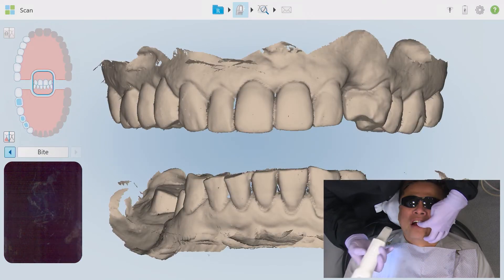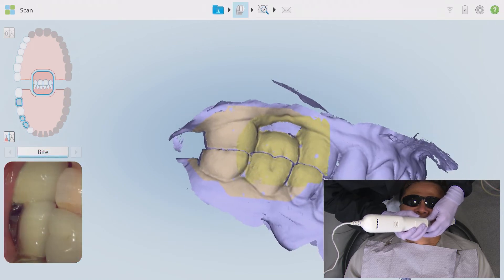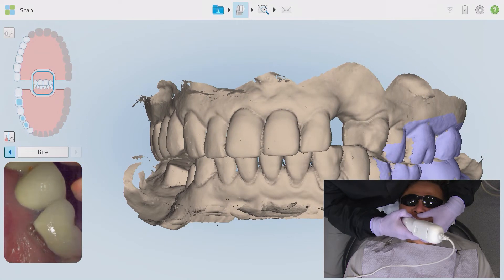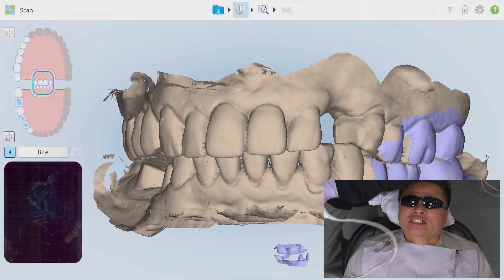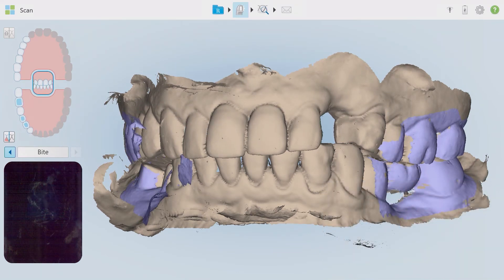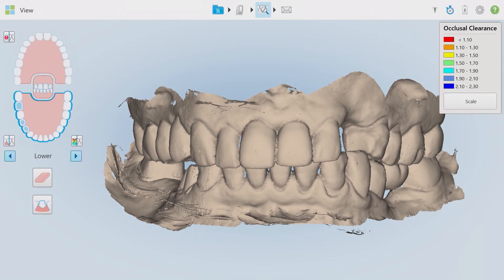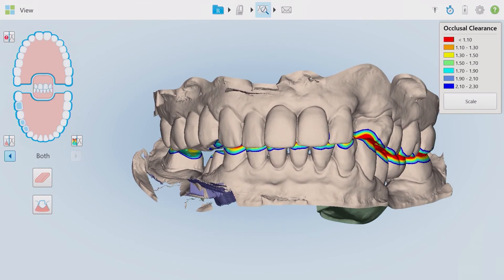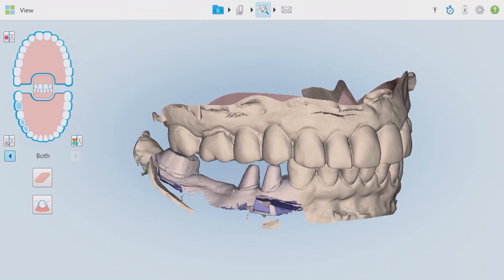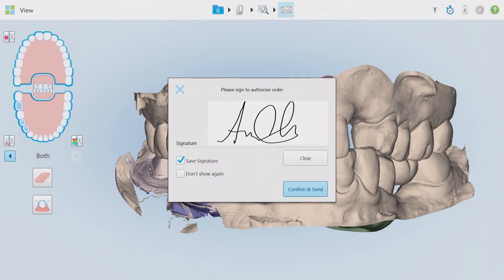I've selected the bite registration option on the chart. I'll place the wand in the opposite vestibule from the prepared side and ask the patient to bite in center occlusion. Start posterior and move the wand in an S or zigzag motion towards the anterior until the arches mesh together. The scan can be stopped after the mesh and then the process is repeated on the contralateral side. It is important, especially in this situation, to capture the bite registration bilaterally on every full arch scan. After ensuring that all scans have been completed and meshed properly, select the view icon to allow the unit to clean up the scans and present them in a high definition format. From here, you can view the occlusal surfaces on a color-graded map. These clearances are set to the final restoration material that's been chosen for this particular case. The occlusal color map can also be turned off and the scan can be viewed in its post-processed high definition state exclusively. When you are finished, give the model one last review and then press the envelope icon to send this case to the lab for final fabrication.